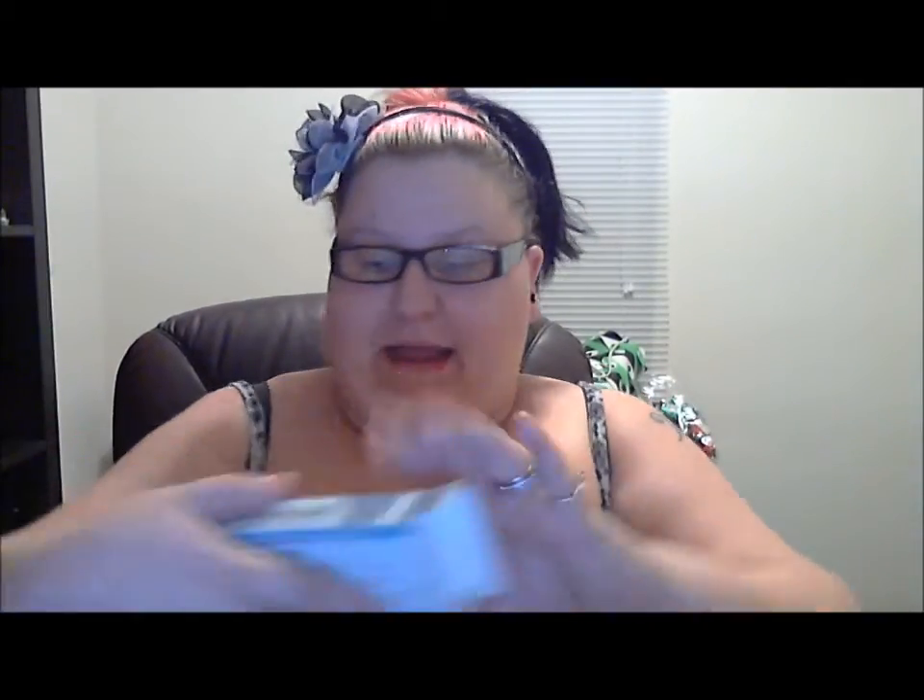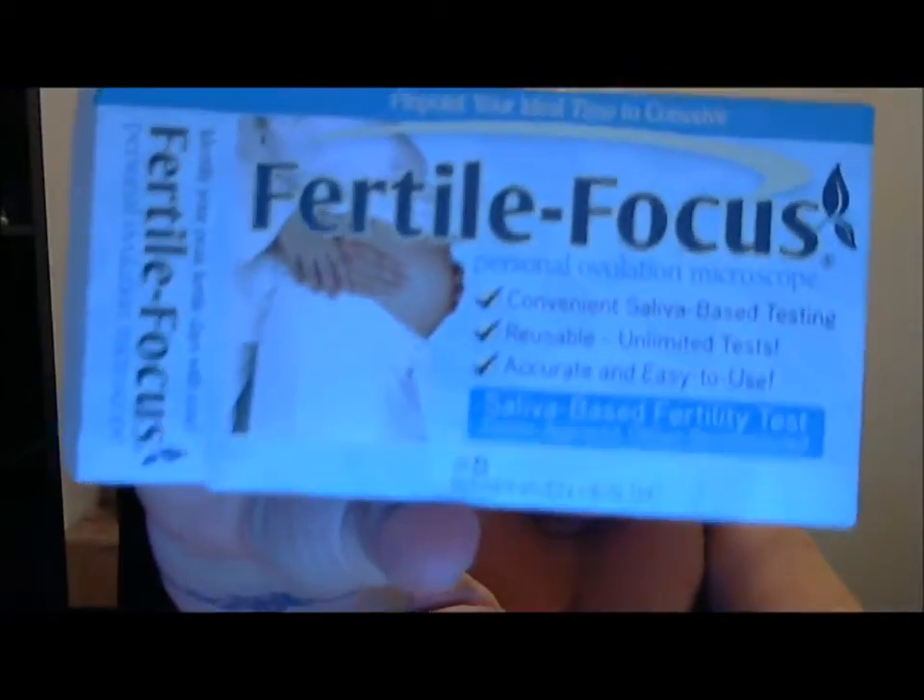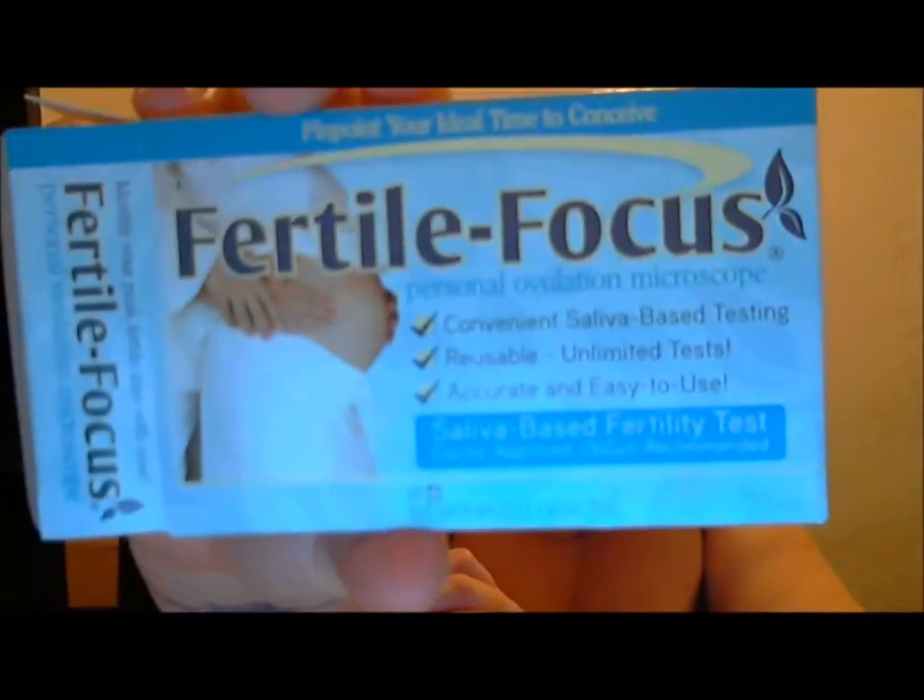I can show you the microscope, but I can't really show you what it does because you have to be able to see it. It is called a Fertile Focus. It is from Fairhaven Health — personal ovulation microscope, convenient saliva-based testing, reusable, unlimited tests, accurate, and easy to use.